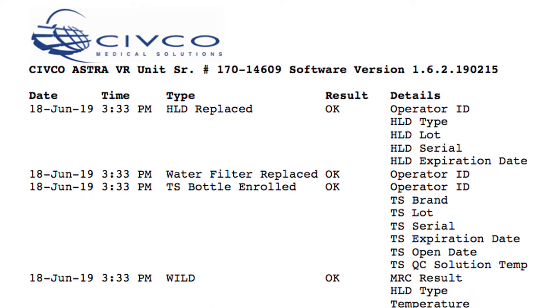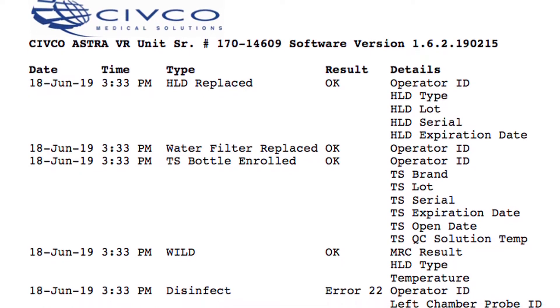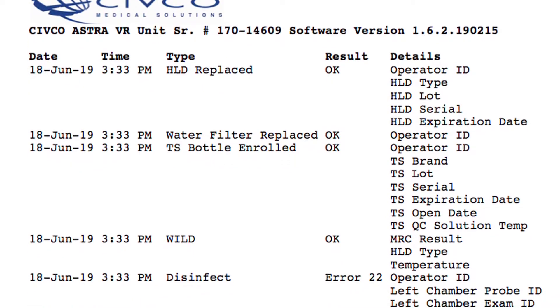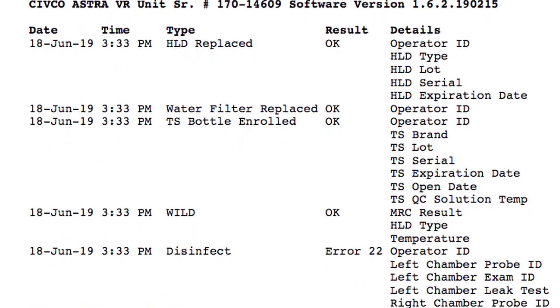The Astra stores the data from approximately the last thousand cycles without any manual input.